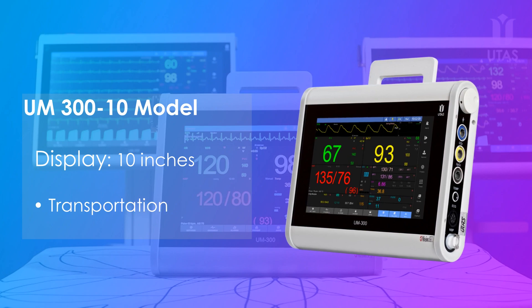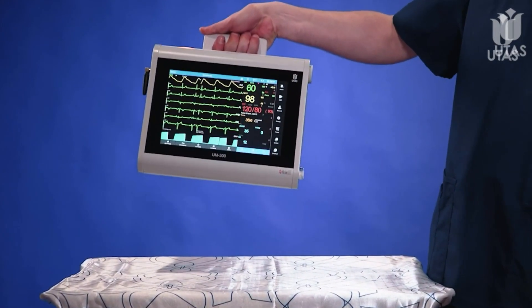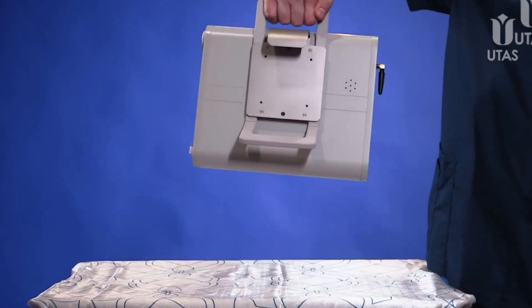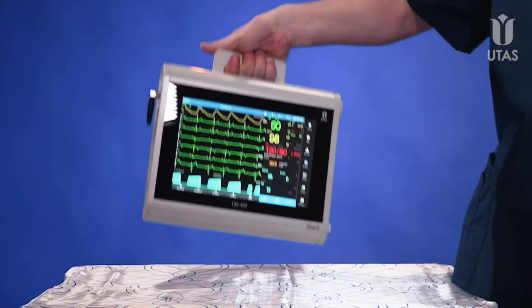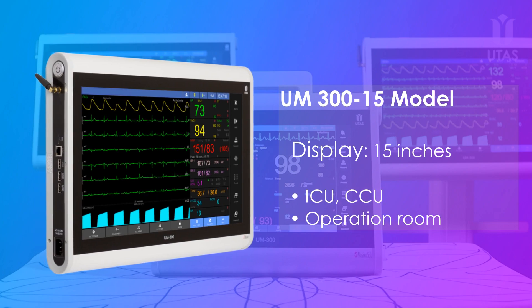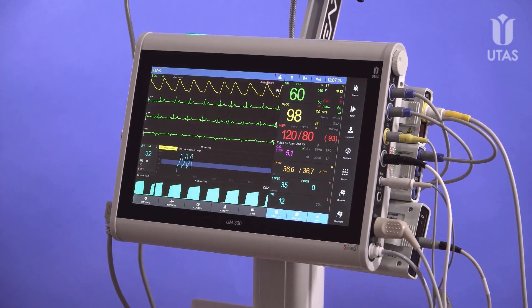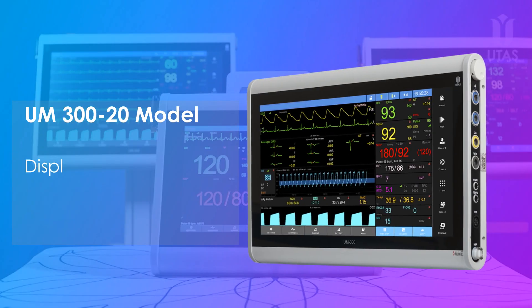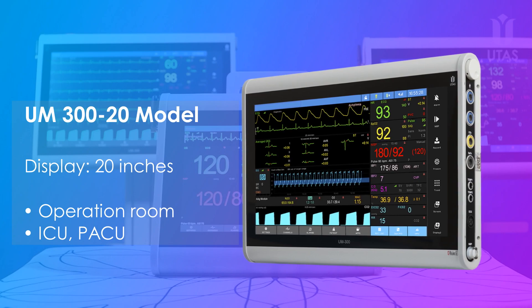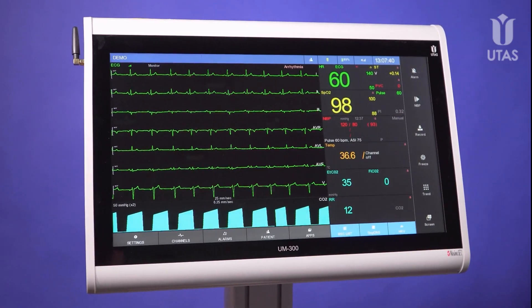UM300 10 is a compact, lightweight, yet full-featured patient monitor, ideal for in-hospital and intra-hospital transportation. UM300 15 is the optimal solution for stationary installation wherever it is needed. UM320, due to its size, is the best choice for operating rooms where a smaller screen size is insufficient.